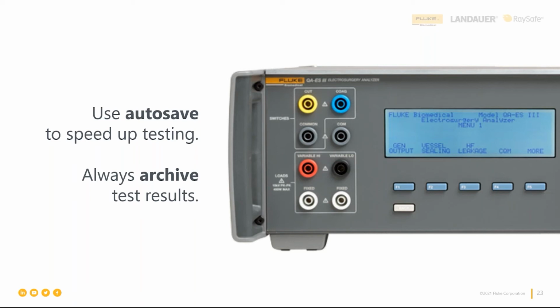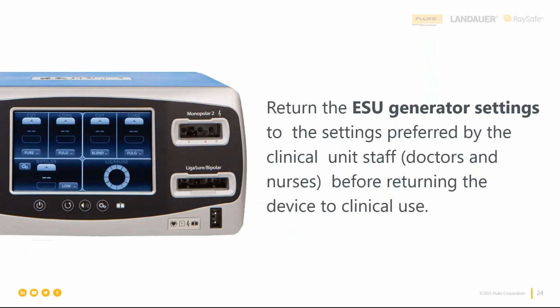But with this, you can hit it, it'll go, and it'll save the answer right there for you to read and write down. Because sometimes the ESU is going to read in amps or milliamps or wattage, and you have to kind of do a little bit of, wait a minute, oh yeah, it reads like this, now I have to translate it over. So it's a really nice way of holding it as well. Yeah, so look into that. It's a really helpful feature.